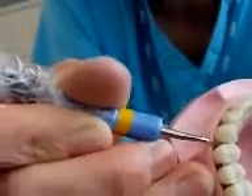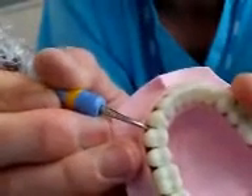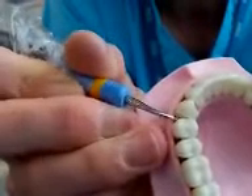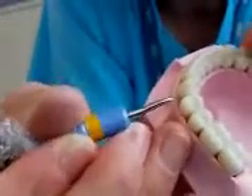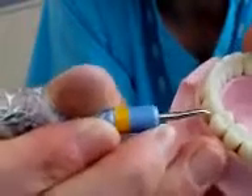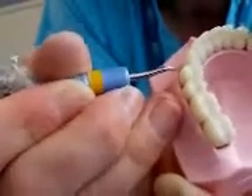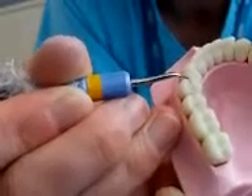Feel the base of the pocket, and then you might just change the angulation a little bit — so you can come up, side-on again. Remember the tooth is not square, so you're moving around in order to get into those spaces. That was the mesial aspect of this premolar here.